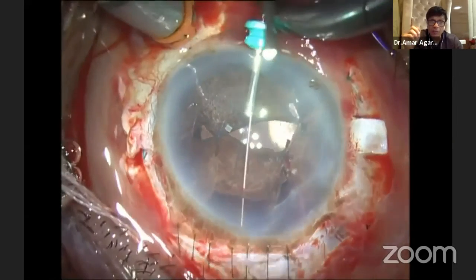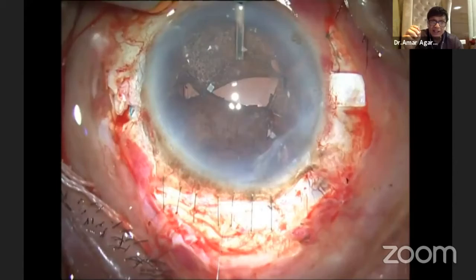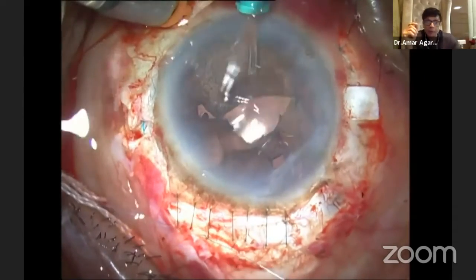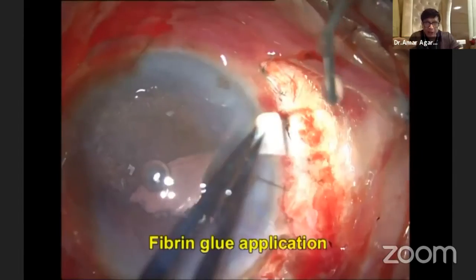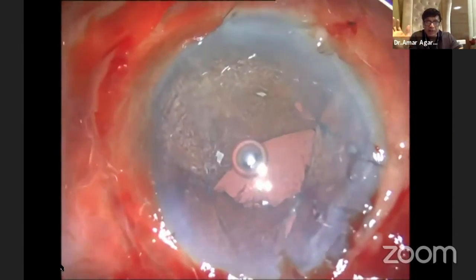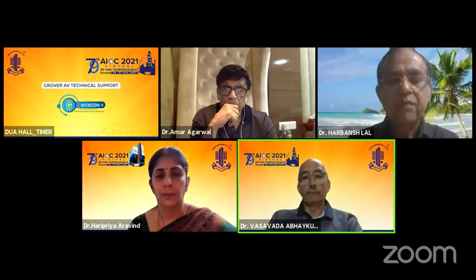The next step is the Purkinje image. The game plan is I need to focus my Purkinje image on the pupil — that is the key factor here. You can see it is bang-centered on the pupil. So now we have the glued IOL in place, the iridodialysis repaired, and the pupilloplasty done. All I need to do is seal everything down with glue and complete the case. That basically completes this presentation about one of the longest days we had. You showed so many of your innovations and all of these are slowly but surely getting recognized all over the world.